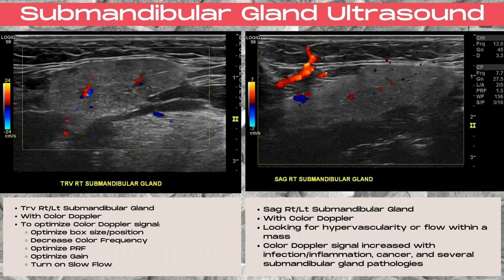Transverse and sagittal right and left submandibular color Doppler images should be taken. To optimize the color Doppler signal, you want to optimize the box size and position, decrease the color frequency, optimize the PRF and the color Doppler gain, and/or turn on slow flow to improve visualization of color Doppler within the color Doppler box.